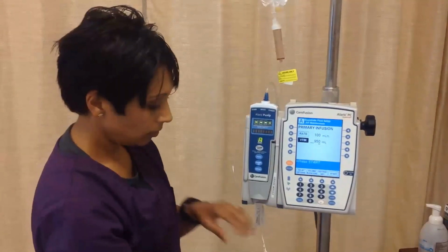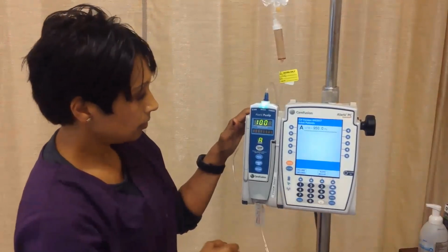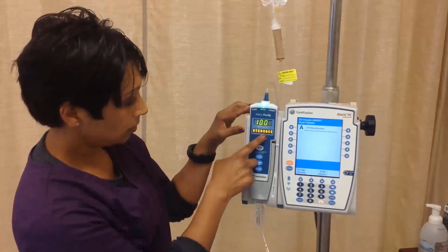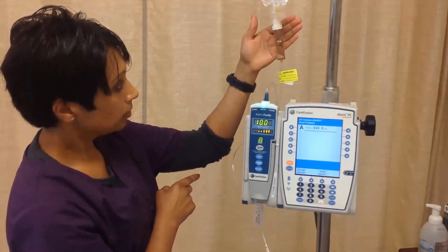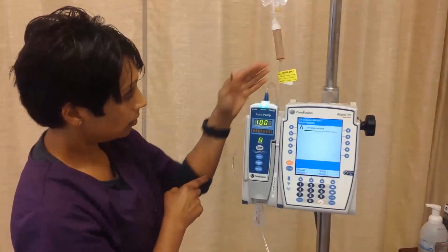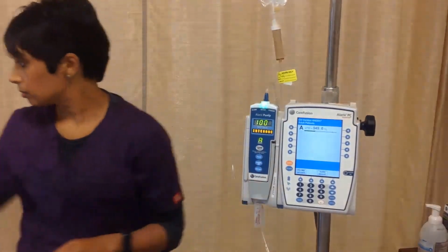Open the roller clamp and push start. Observe the pump until there is a green light and observe your drip chamber to ensure proper flow. If there is an error, read the prompts on the pump display and follow directions. Because the access device is a PICC, place a green Curos cap on the top valve.